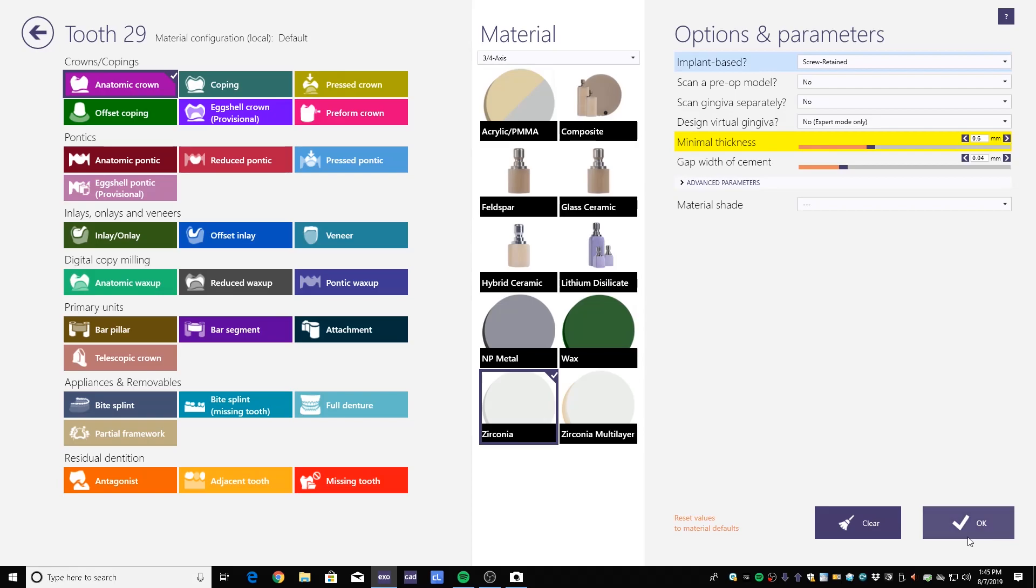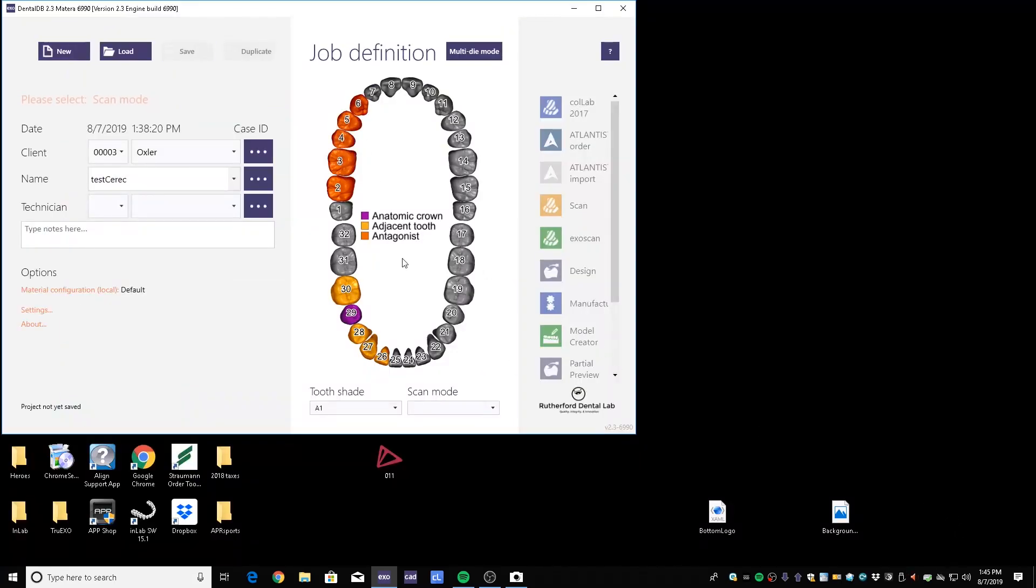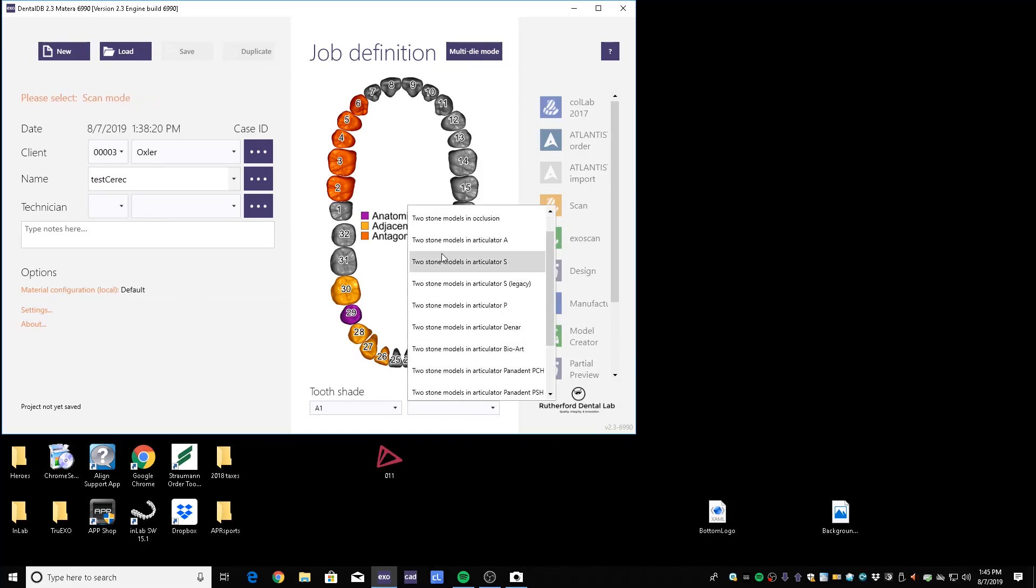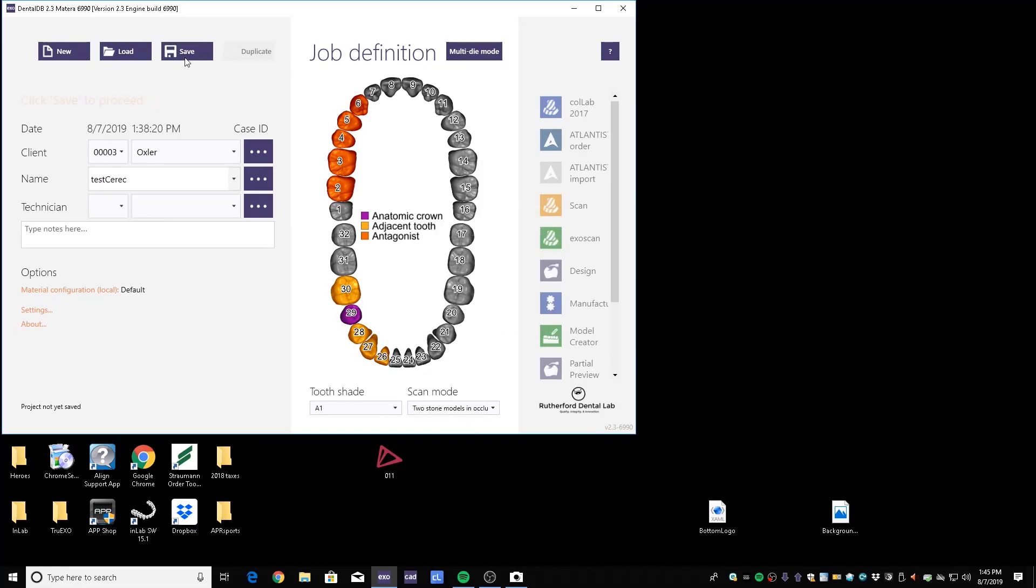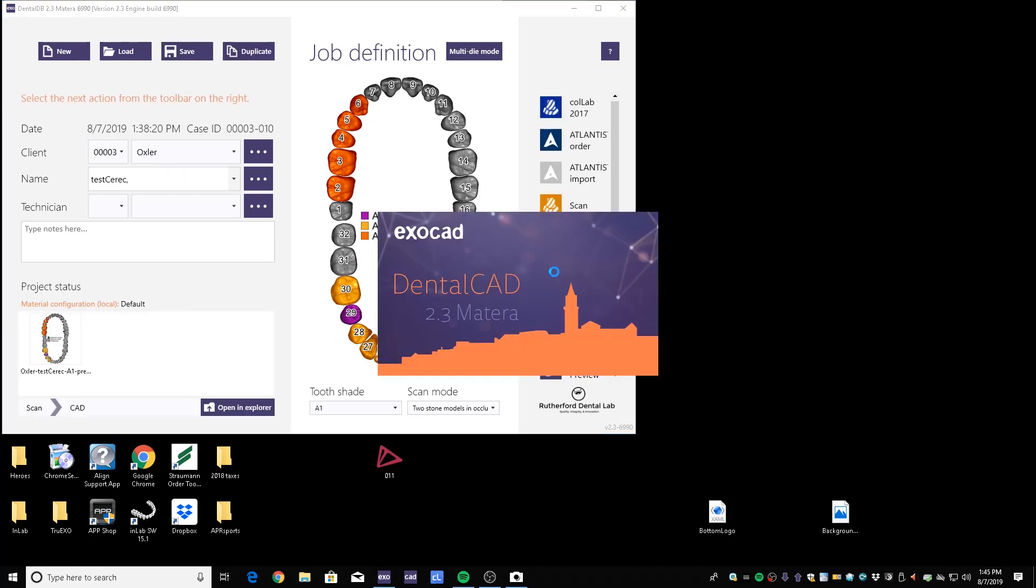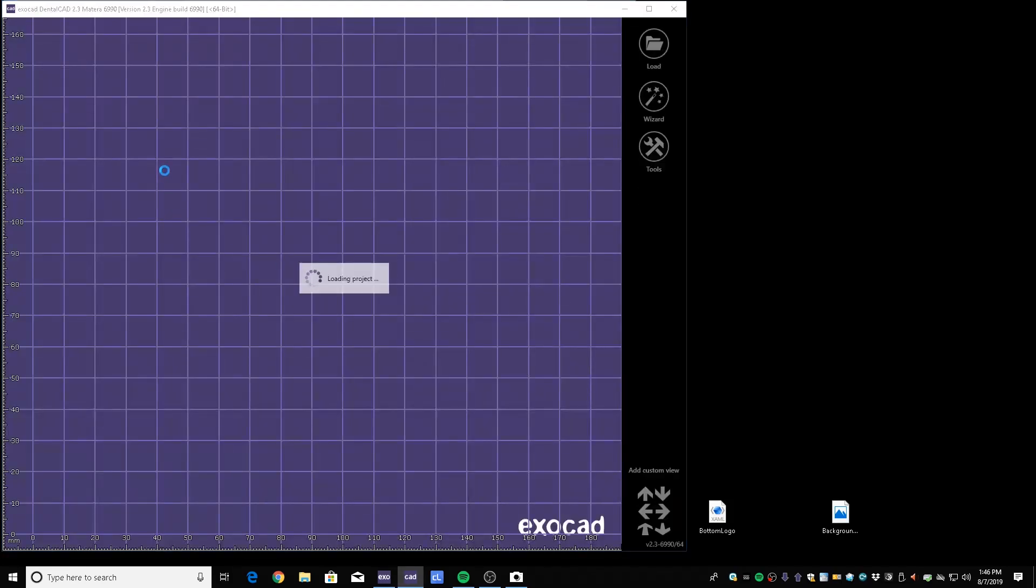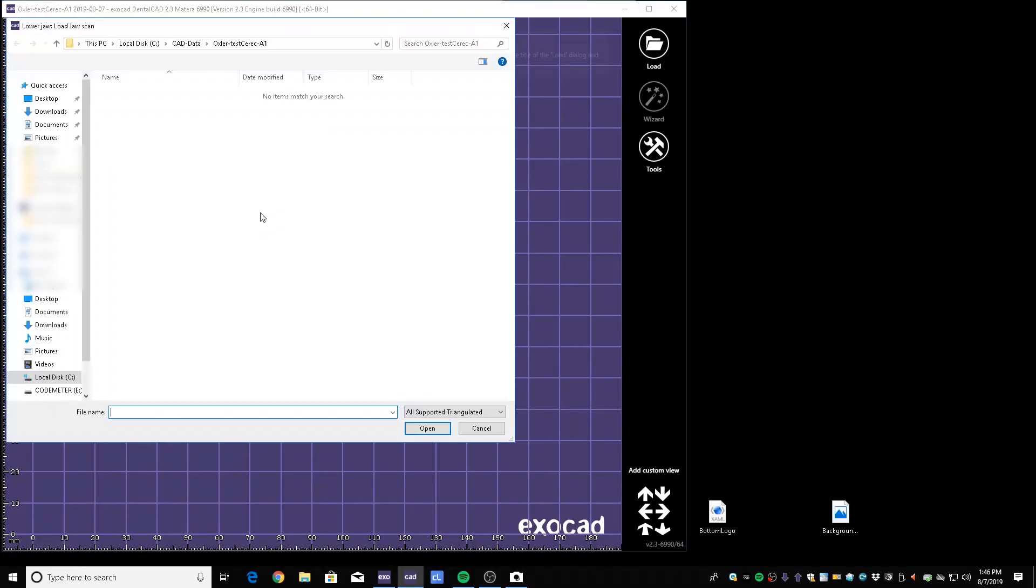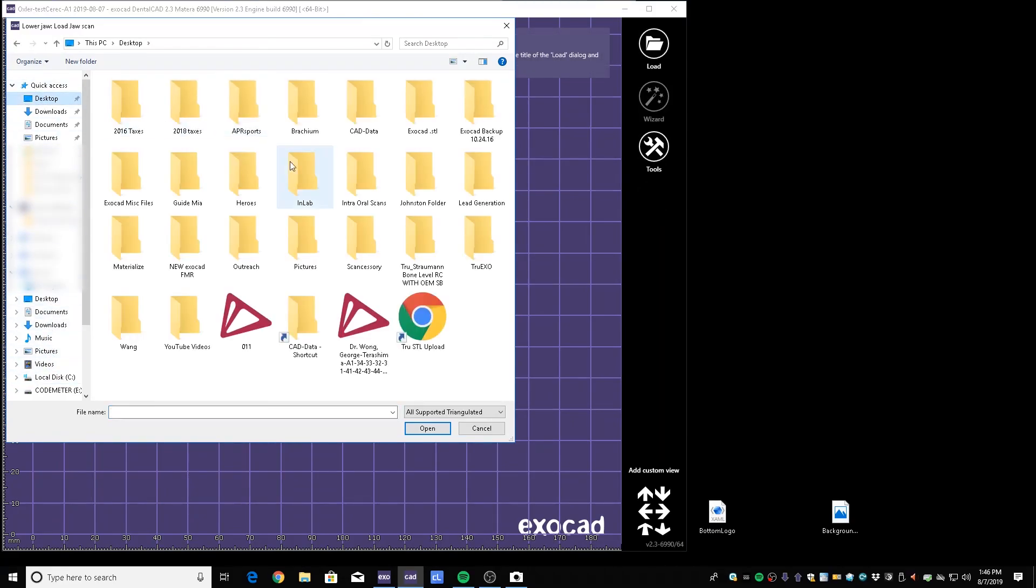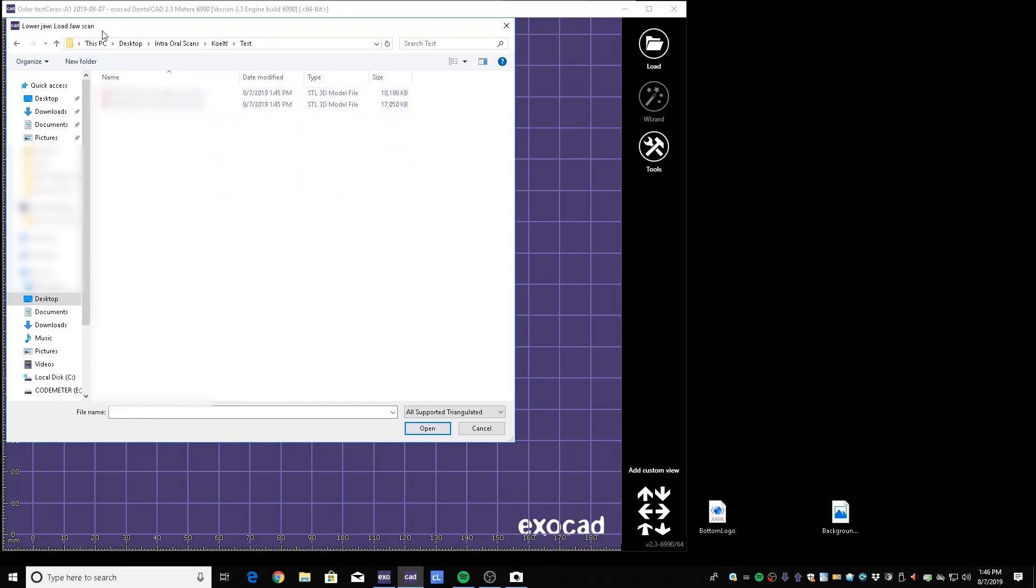We'll start a case: test CEREC, it was a number 29, and it was a screw routine. Go ahead and import like you normally would. Save and then we'll click on design.